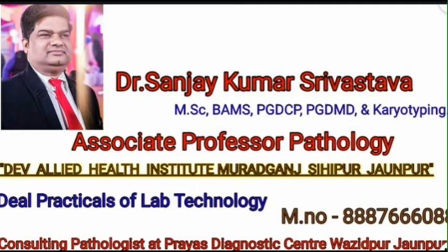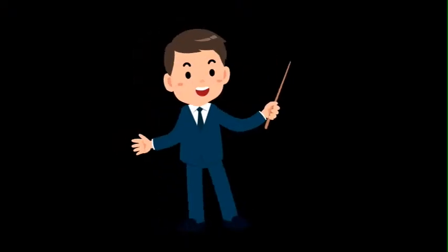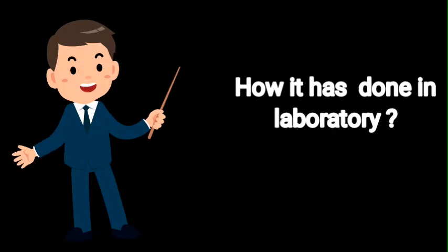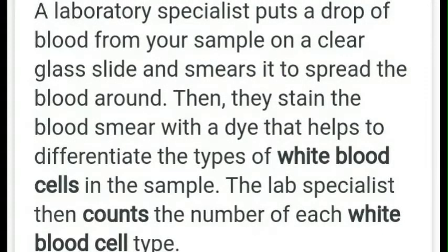And today my topic is the practical of DLC, differential leukocyte count, how it has to be done in the laboratory. A laboratory specialist puts a drop of blood sample on a clear glass slide and smears it to spread the blood around.